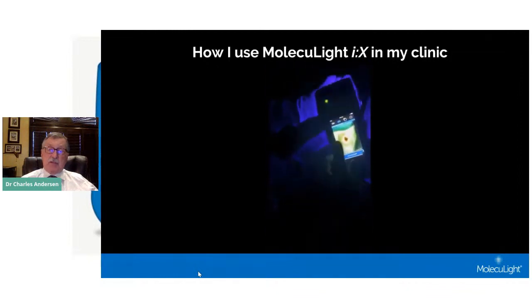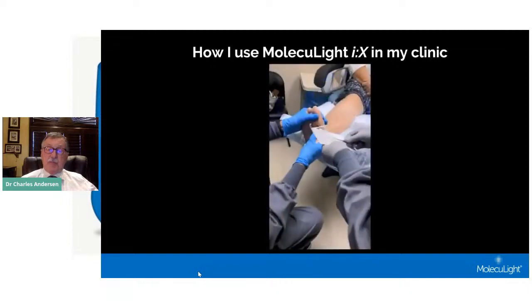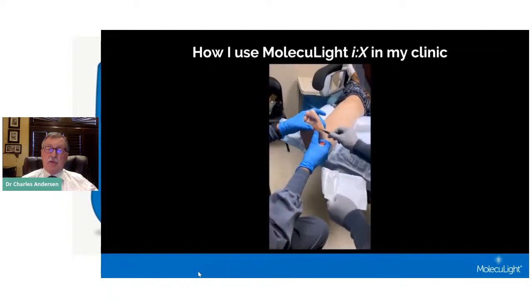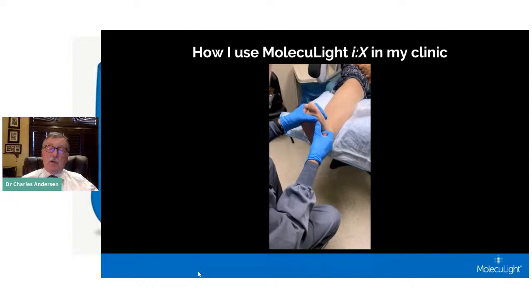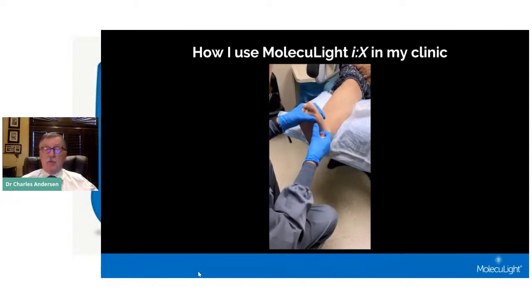Now, in this particular patient, this is a patient with a diabetic foot ulcer that we're also using biologic tissue on. We feel very, very strongly that if you put biologic tissue on a colonized wound, you're just wasting a lot of money. And as all of you know, some of these products cost as much as $2,500. So prior to the placement of any expensive biologic tissue, we make sure that there's been adequate debridement, that we've removed any bacteria as judged by the fluorescence, and then we proceed with the application of the biologic, appropriately offload that patient and apply a total contact cast.